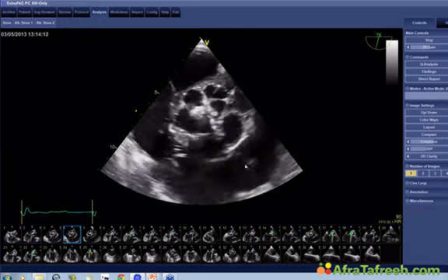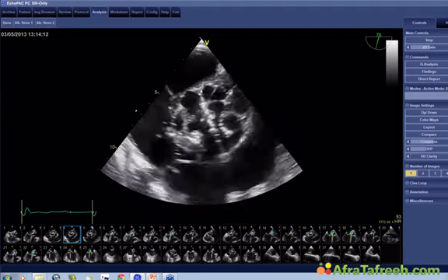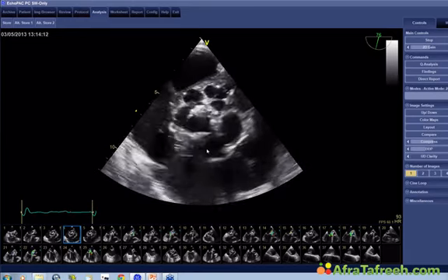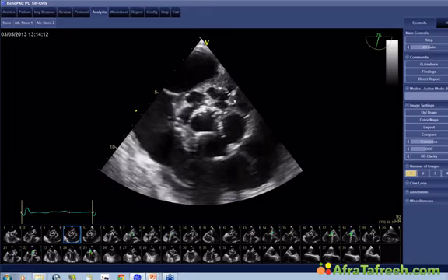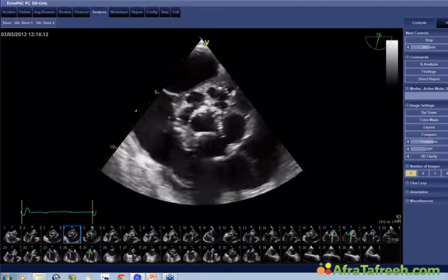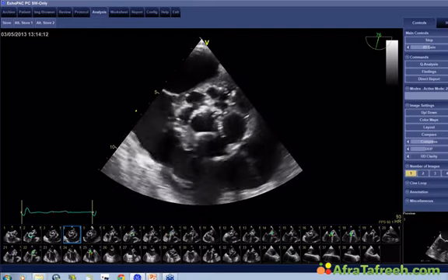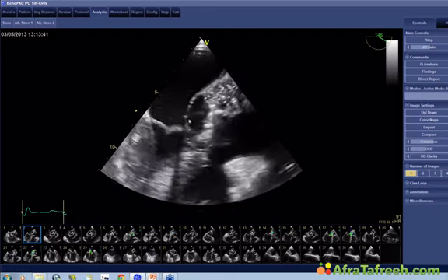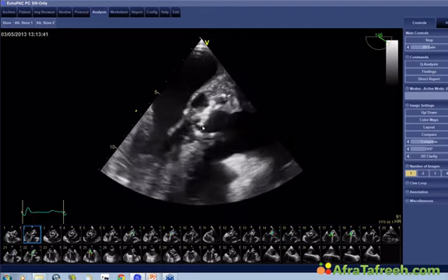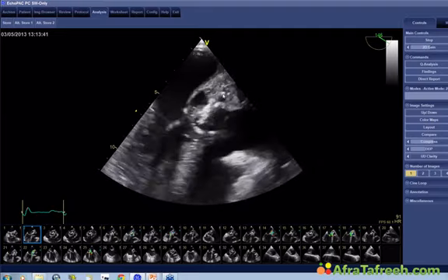Here we have a massive infection with septations of a large pseudoaneurysm. This here is the aortic valve, 1, 2, 3 cusp, and around the aortic valve we have a honeycomb-like appearance of a pseudoaneurysm. What is a pseudoaneurysm? I will show you later in the diagram on the slide, but here is the intervalvular fibrosa, and there seems to be a disconnection between the intervalvular fibrosa and the aortic valve. So blood can enter here and cause this structure to pulsate.